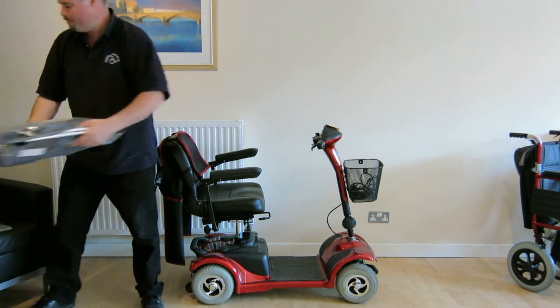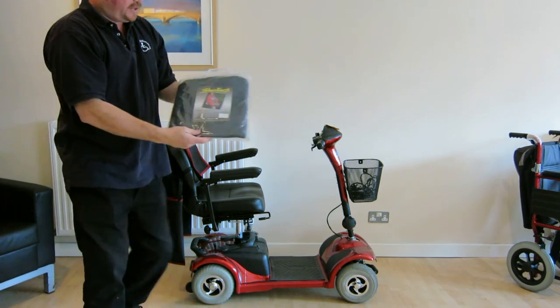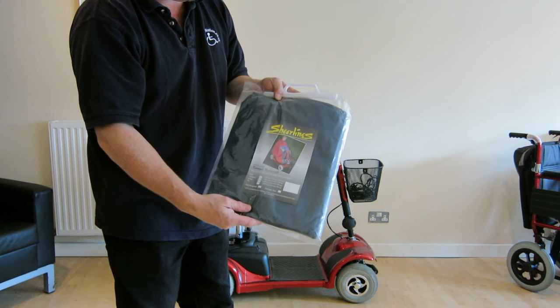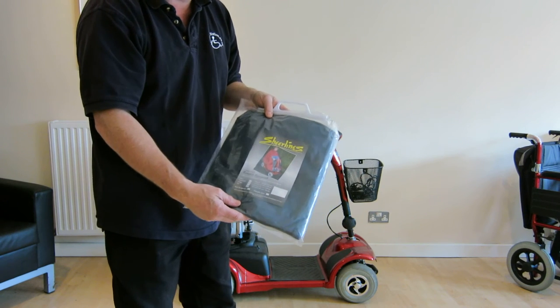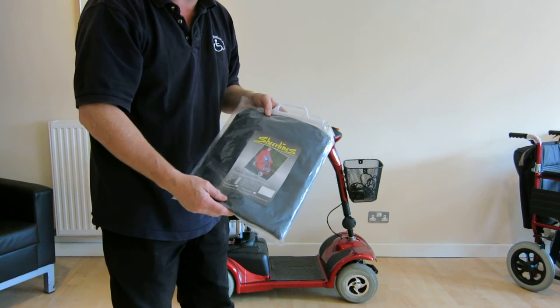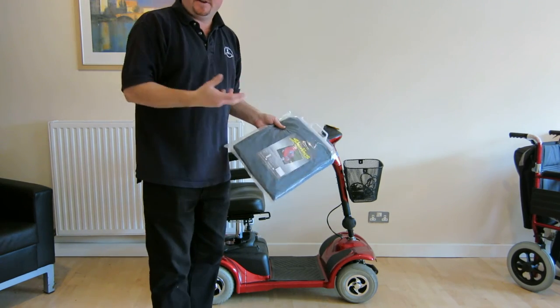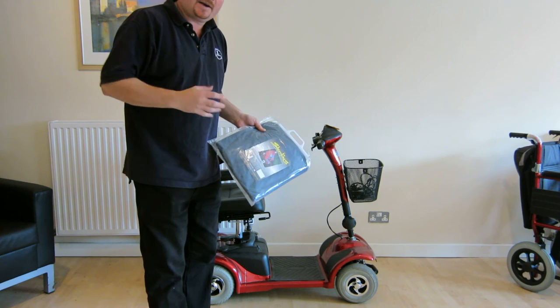So that's the cover. We also offer a ride-on zip-up cape. It covers both the rider and the scooter in the event of an unexpected shower of rain. So you can zip yourself up and you can pull the hood over in the event of a shower of rain and you can carry on riding.